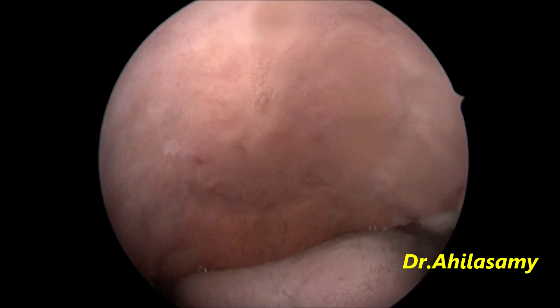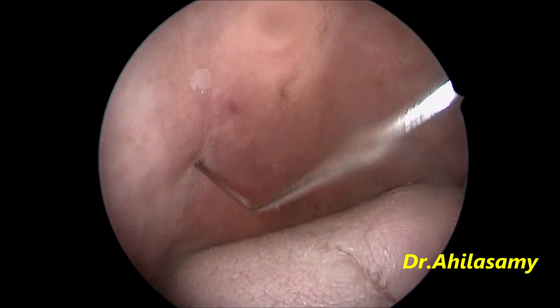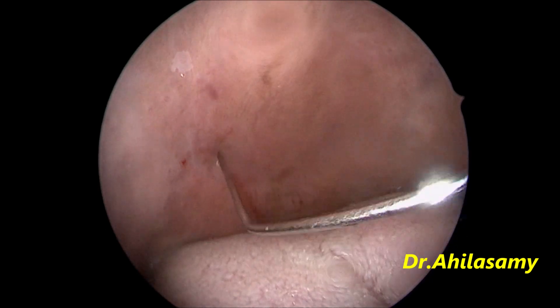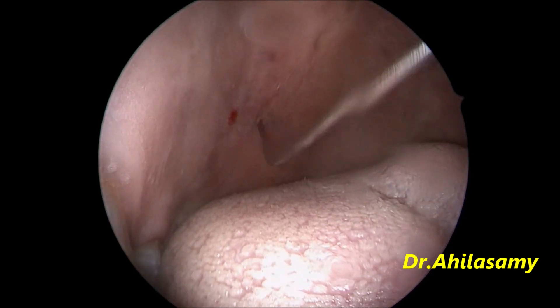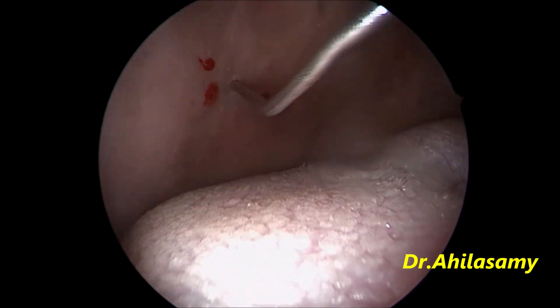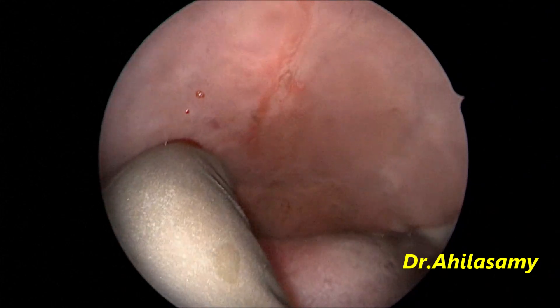I am palpating the greater palatine foramen, which is the only foramen in the hard palate that will allow the needle to go in. I palpated but I couldn't feel it clearly, so I am again giving the block blindly, but the needle is not going in. No other area will allow the needle to go in. The needle has already been bent for around one and a half centimeters. I am giving multiple pricks, but I still couldn't find the foramen, which is very important because I have taken the patient under local anesthesia. So again I am palpating for the foramen.